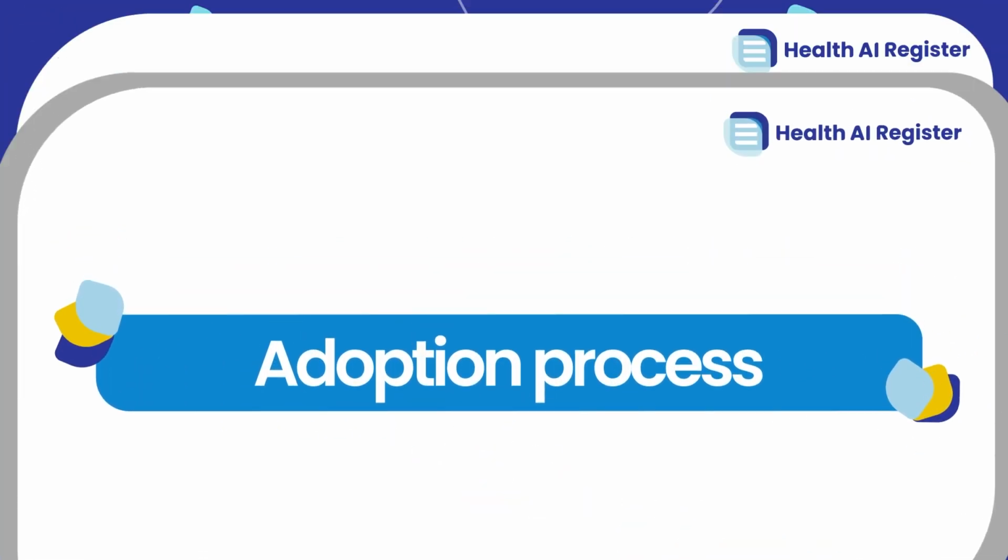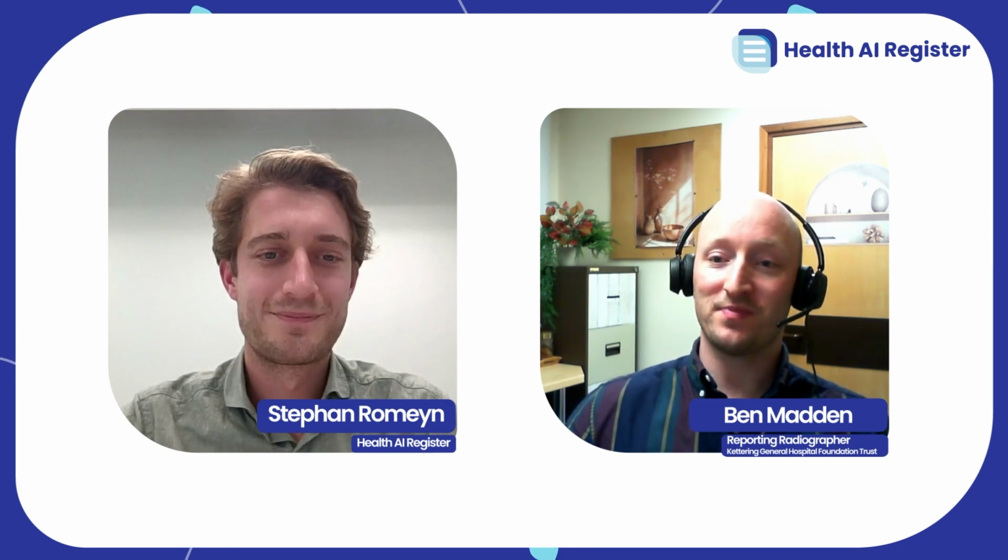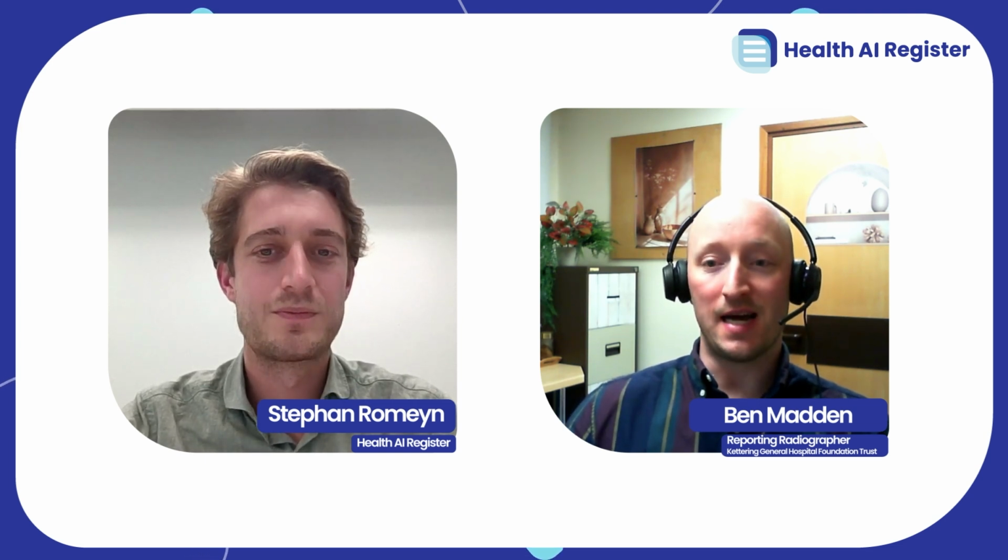And how was the adoption process in your department? Of course, sometimes it can be difficult to truly adopt and let everyone use it in clinical practice. How did you see that? Well, first I found ED were really supportive. They're really great. As a reporter, we're all very skeptical, and it took a while, especially at the start where the system wasn't as good as it is now, for us to trust it and believe in it.